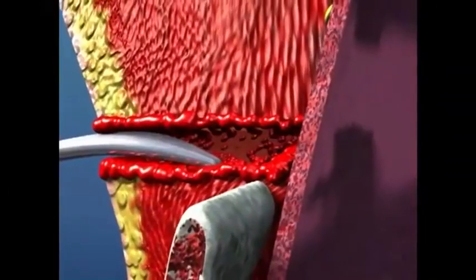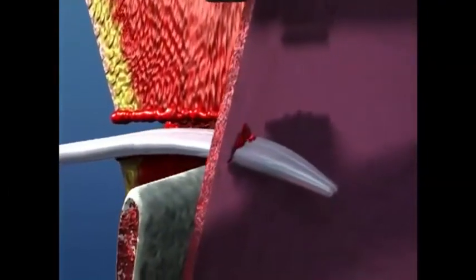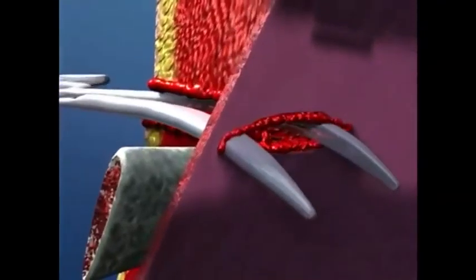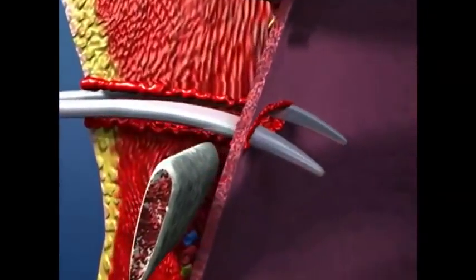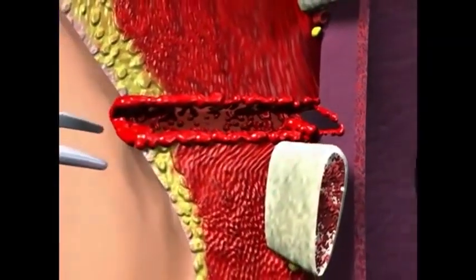Be sure to enter the pleura in a controlled fashion to avoid lacerating the lung with the hemostat. Once inside the pleura, spread the hemostat widely and withdraw it while still open to create a sufficient opening in the pleura for the chest tube.